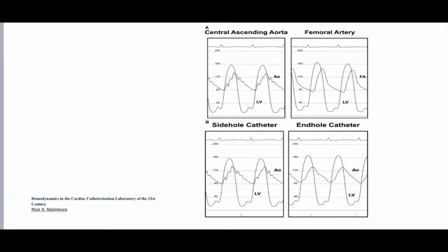Okay. Now look at the B, side hole catheter versus end hole catheter. You see, the end hole catheter has led to maybe overestimation, damping.